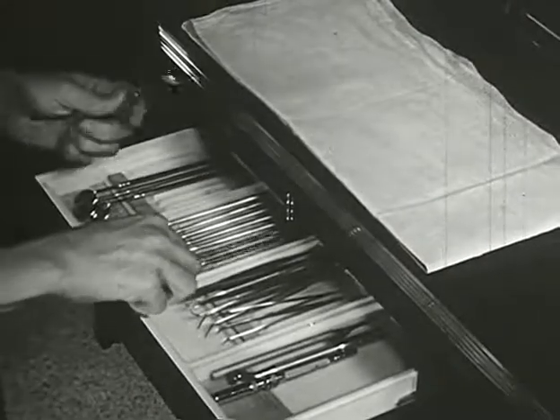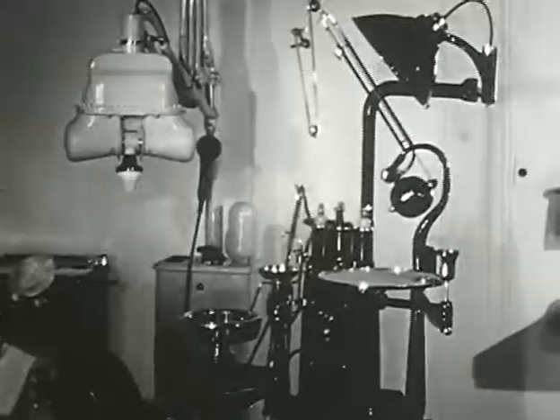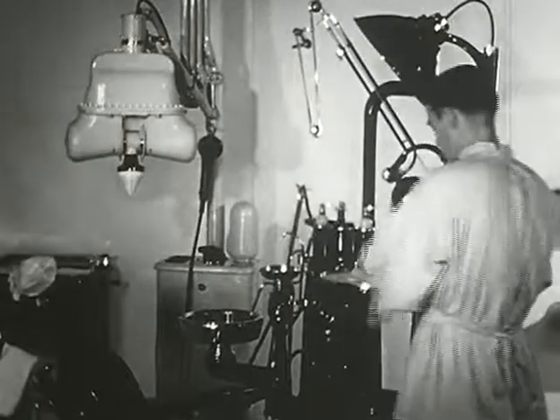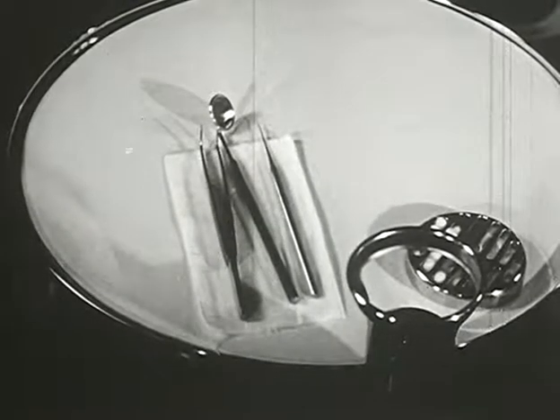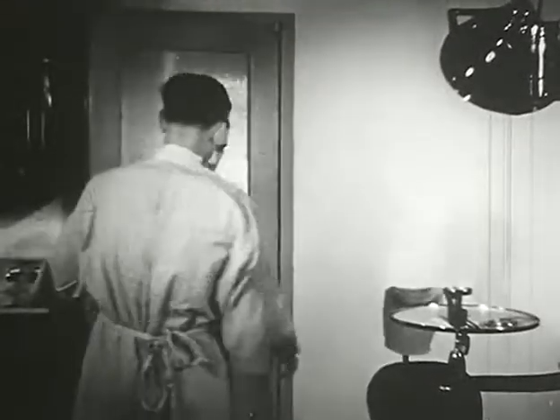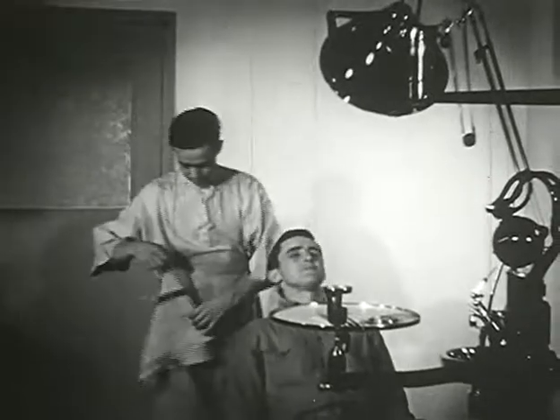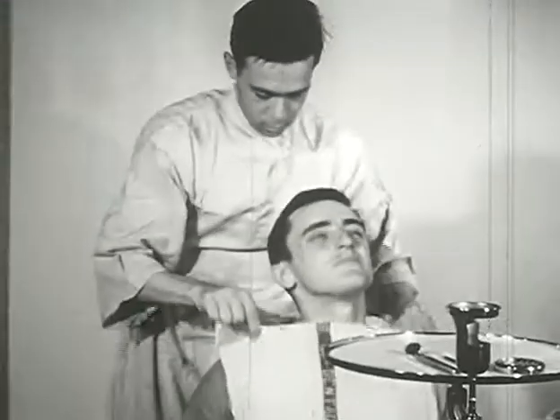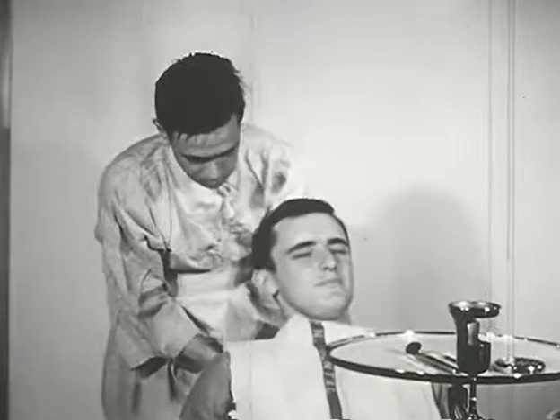The three examining instruments are laid out for the dental officer: mirror, explorer, and cotton pliers. Since this patient's appointment is for a routine examination, every patient receives a clean headrest cover and a fresh towel.